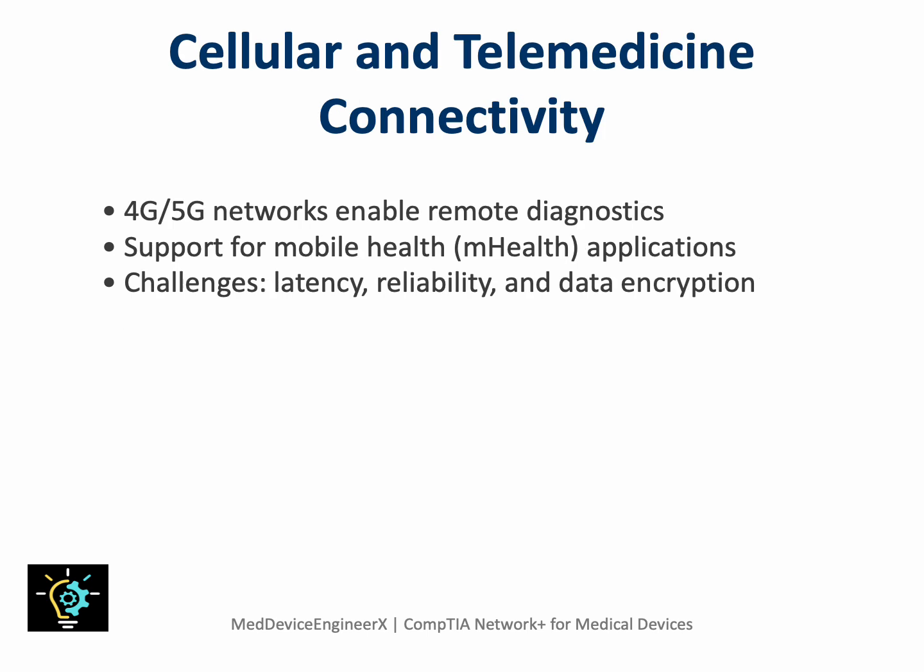Let's talk about cellular and telemedicine connectivity. Cellular networks include 4G and 5G, and these are revolutionizing telemedicine and mobile healthcare. These networks enable clinicians to remotely monitor patients, transmit diagnostic data, and even adjust device parameters securely. 5G in particular offers ultra low latency and high bandwidth, which is ideal for real time monitoring and AI driven decision systems.